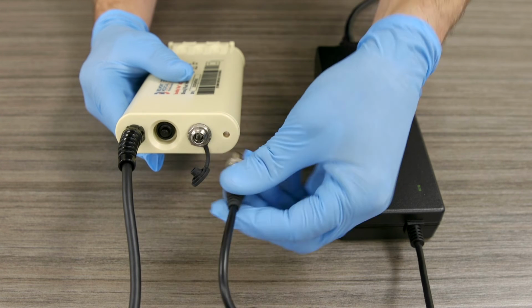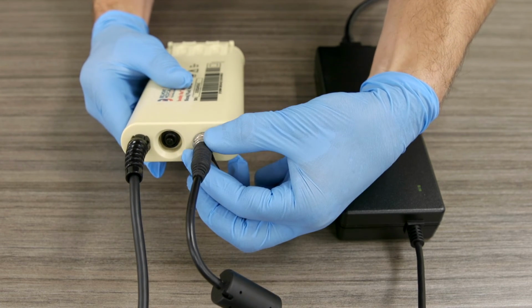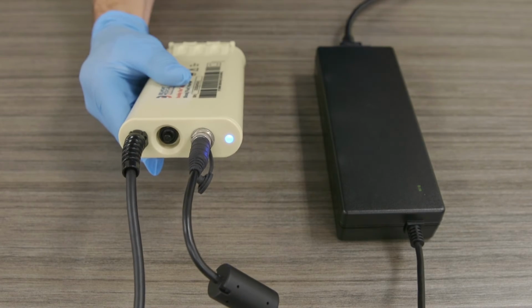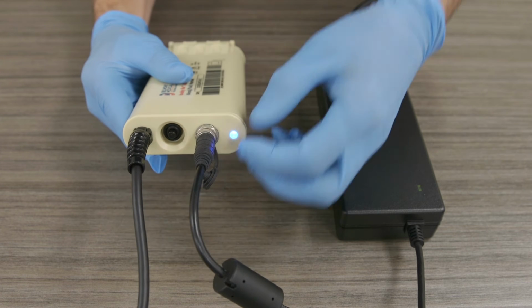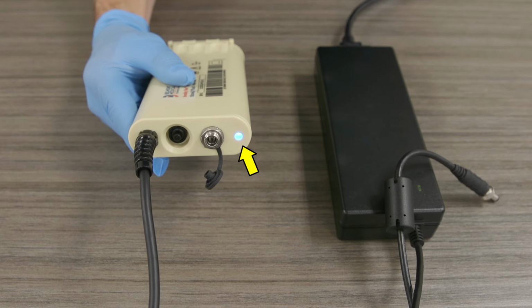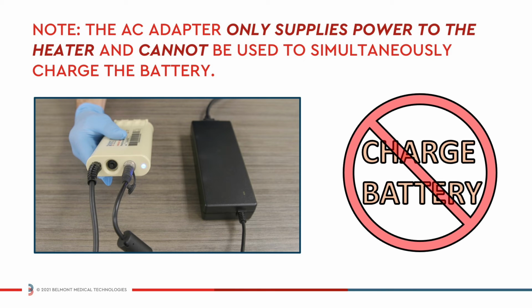To operate the system on AC power, connect the AC-DC power supply to the AC adapter on the bottom of the battery housing, and then connect the AC-DC power supply to the power source. The on and off switch controls power to the heater unit from either the battery pack or the AC-DC power supply. When the AC-DC is disconnected, power will revert back to normal battery operation. Note, the AC adapter only supplies power to the heater and cannot be used to simultaneously charge the battery.